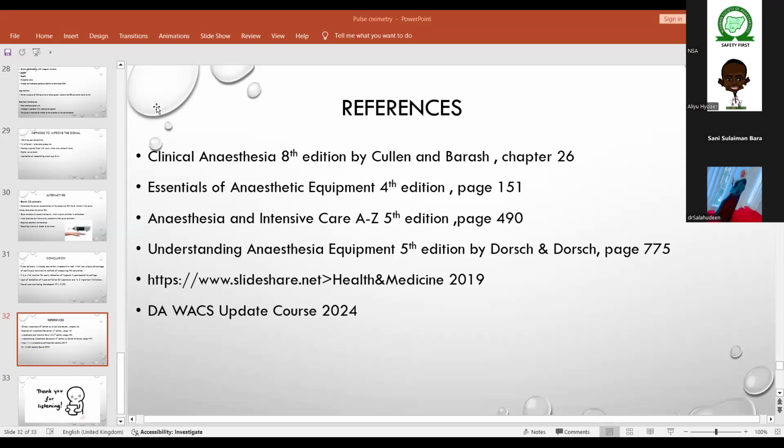Then the limitations that you mentioned, like the advantages and disadvantages, the different wavelengths in the absorbance that are analyzed, and the transmitted light, the signals can have interference, maybe electrically or by ambient light, that alters the reading. Then some conditions, like septic patients with obstructive or restrictive lung disease, are hypoxic and some are hypercapnic. So we might not rely on it, because it just gives us a fraction of their saturation.